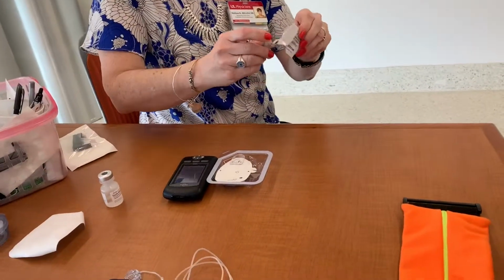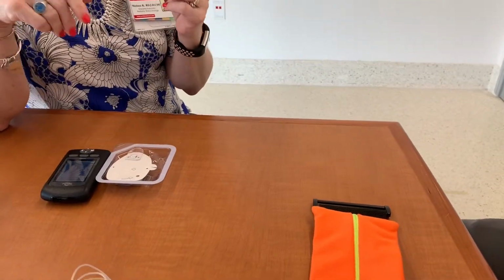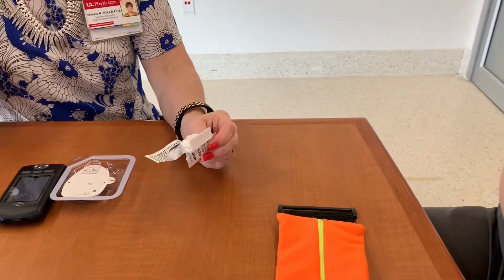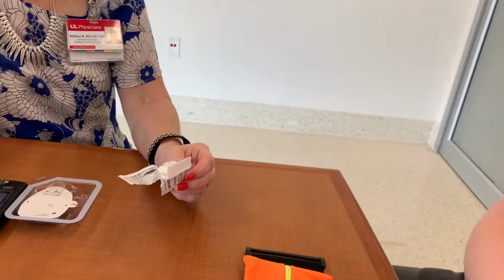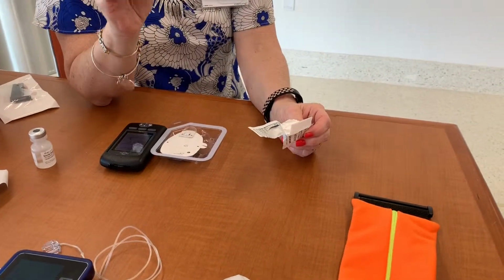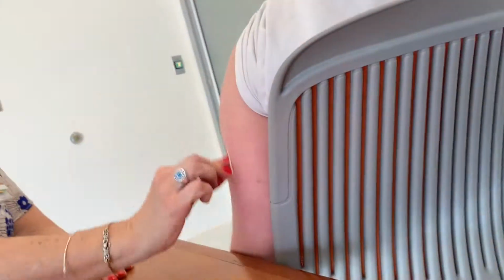Now he's always anxious about, Mom, did you get it in the muscle? Did you get it in the muscle? It's not going to go in the muscle. I promise. Is it a big deal? Can you get it in the wrong place is what we're asking. Okay. No. So it's so short. Your muscle.